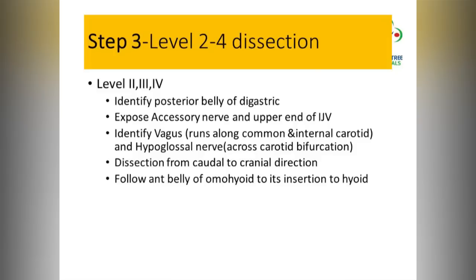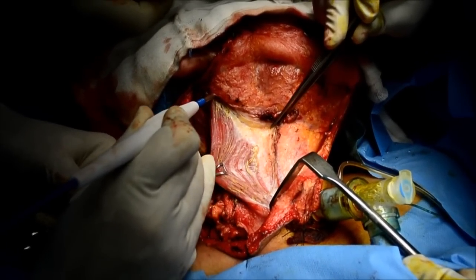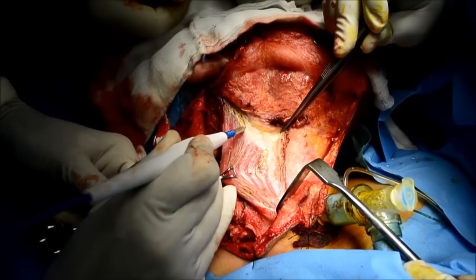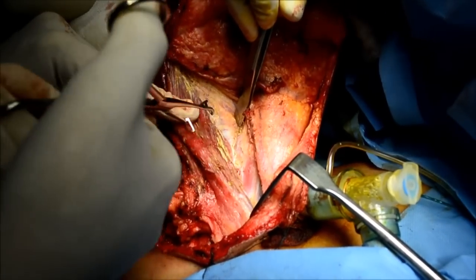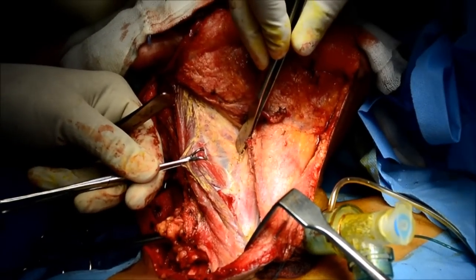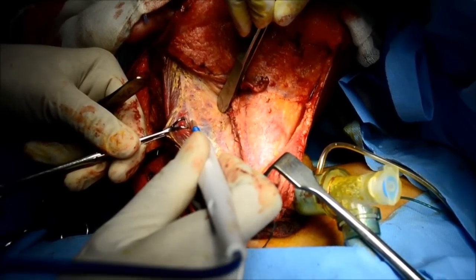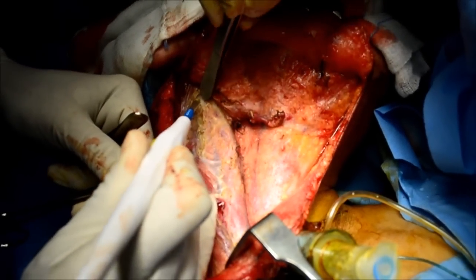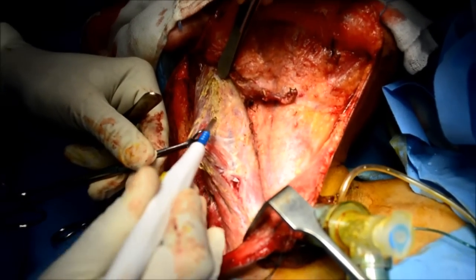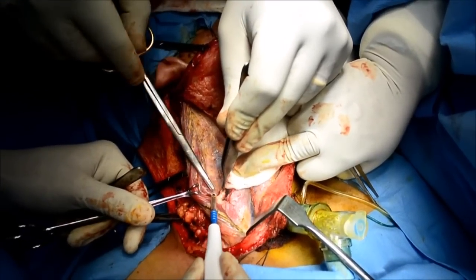Once that is done, the third step is to clear the lymphatic levels two to four. The sternocleidomastoid is hugged and a retractor is used to give counter-traction. You slowly start the dissection from the apex, go lower down, and be constantly vigilant about the accessory nerve. Your assistant gives counter-traction and you hug the sternocleidomastoid muscle.